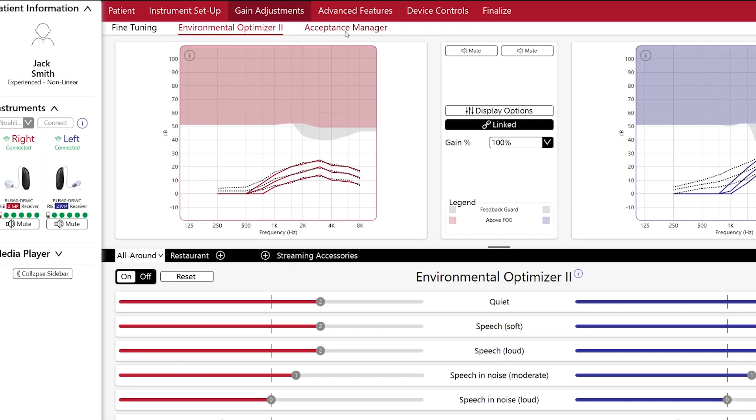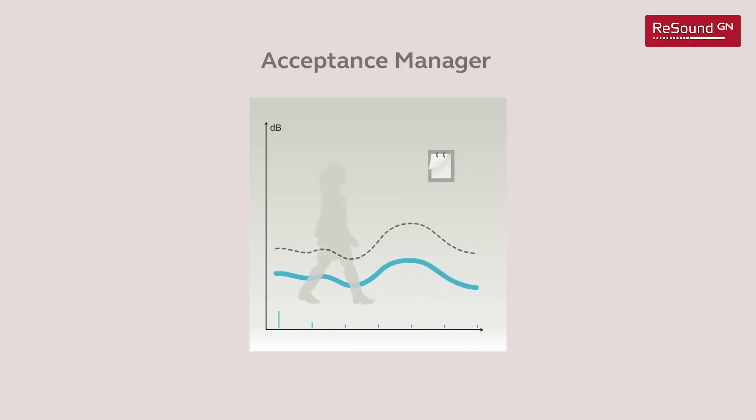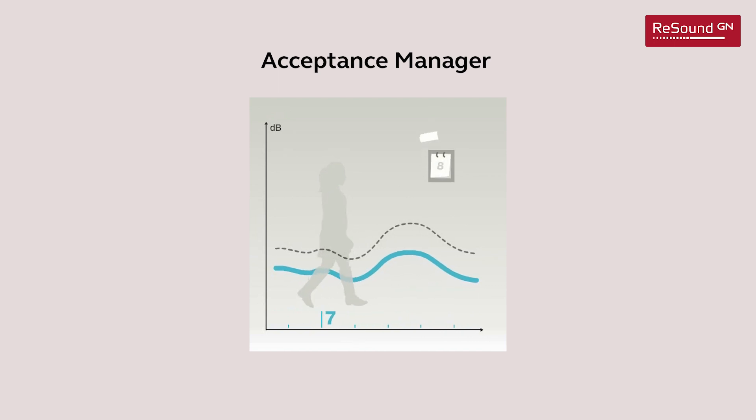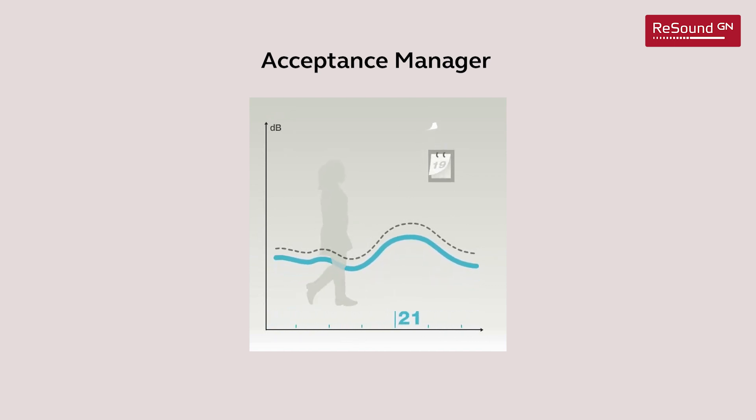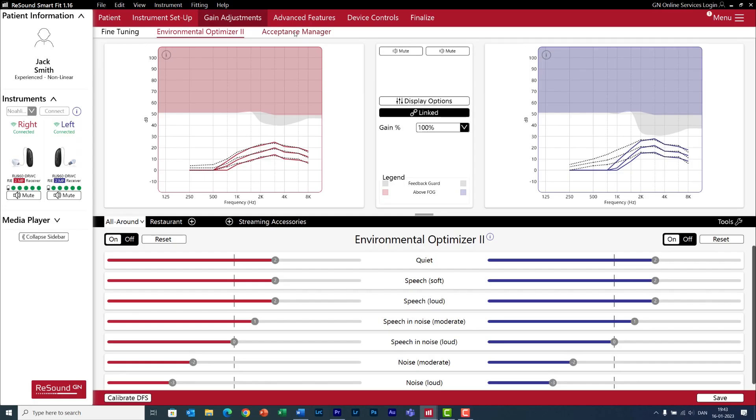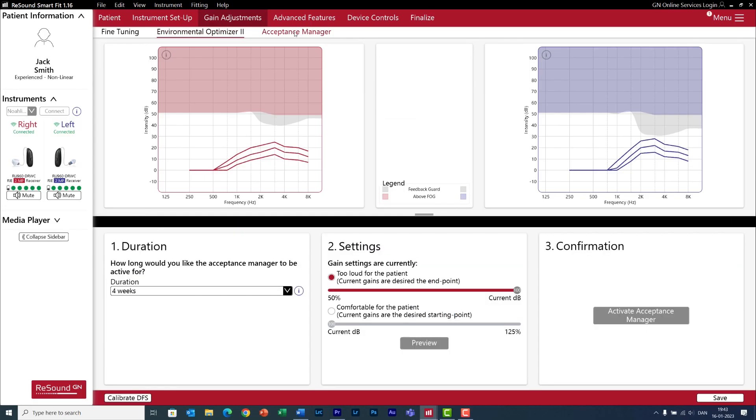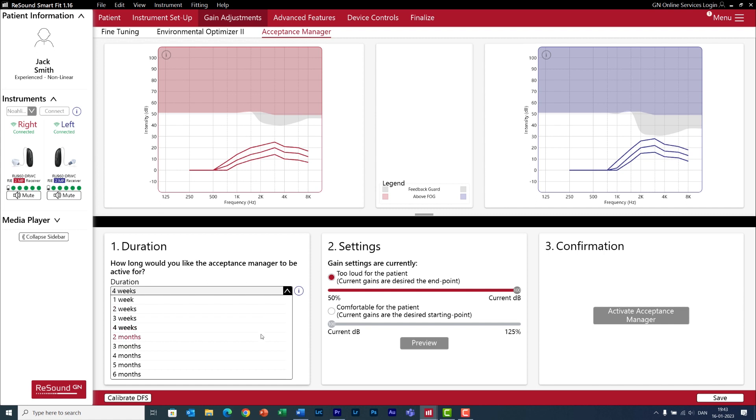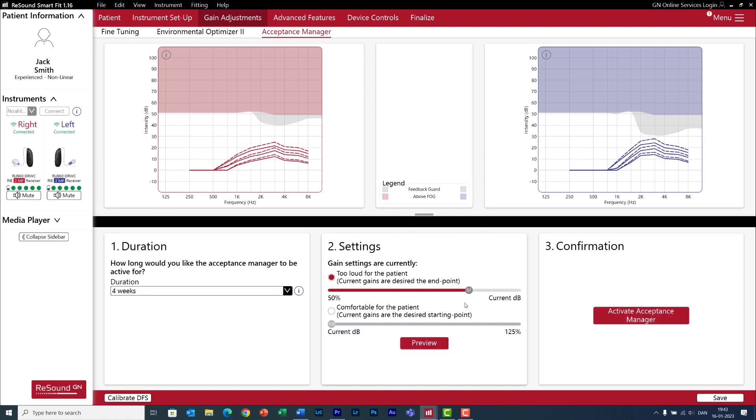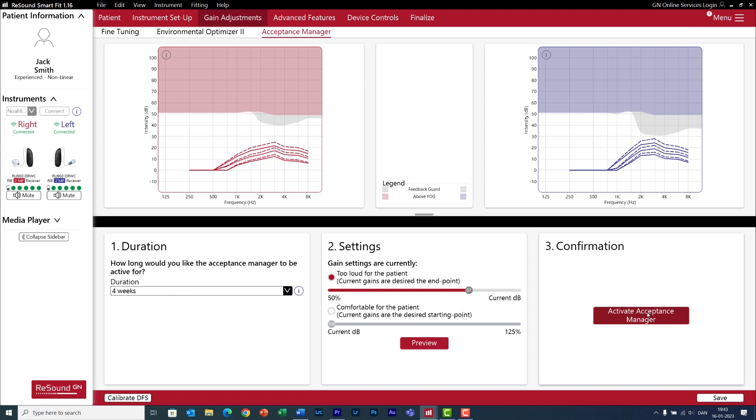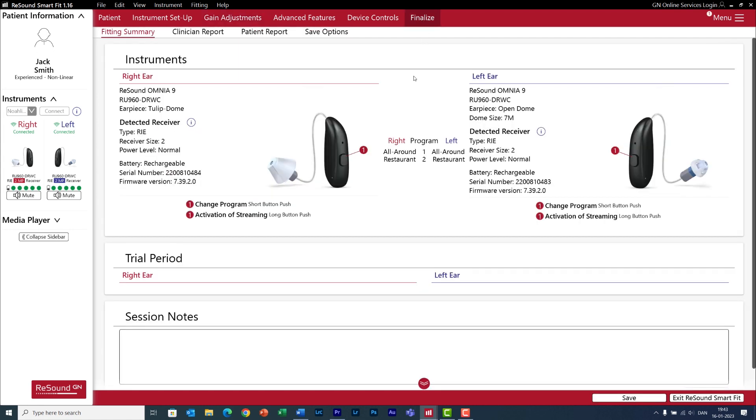In Gain Adjustments, now you will also find the Acceptance Manager. With this feature, you can help your clients get used to the sound of the hearing aids by gradually increasing the gain over a period of time. It's very easy to use. You can select for how long you want the adaptation to be. Then you can lower the gain to decide at what level you want to start from. And activate the Acceptance Manager. And when you are happy, you can go to Finalize, review your settings, and save the session.